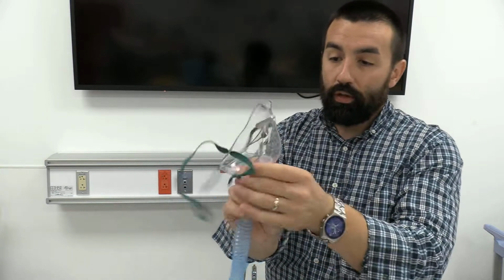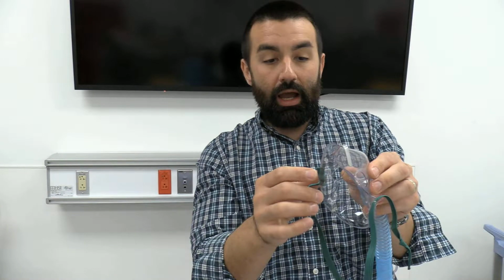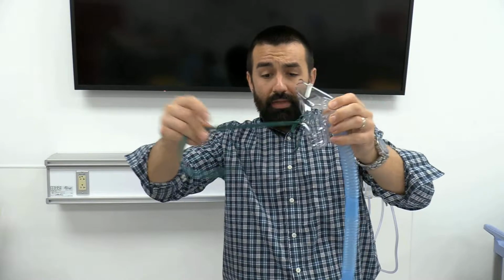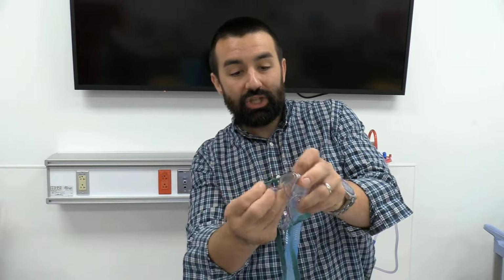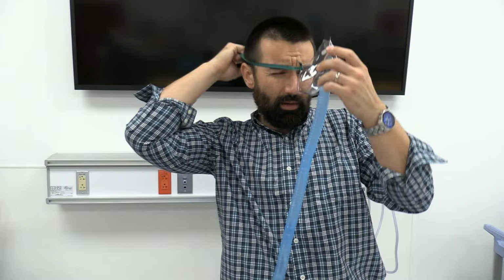I want to point out with all of these masks, you've got just a simple elastic band that you're pulling through an opening to snug it up on a patient. On these particular ones, I'll put a little simple knot in the tag end of that. That way it can't pull out. If you pull this out too far when you're taking it off a patient or putting it on, it is about impossible to put back on without a lot of effort, okay? So I usually will just tie a knot at the very far end, and it's usually way bigger than most people's heads. And I've got a ginormous head. So you can do that so it doesn't get pulled out.